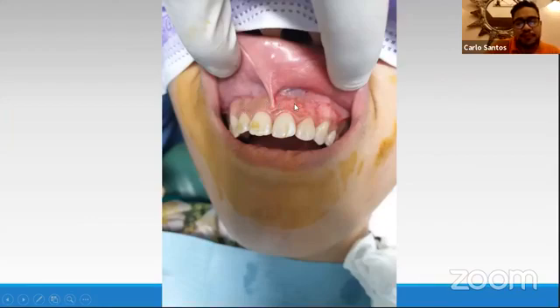This is the surgery day itself. Sorry, this is betadine. I don't know if you prep your patients, but in doing oral surgery procedures, always prepare your patients with a sterile area, and prep it using betadine.